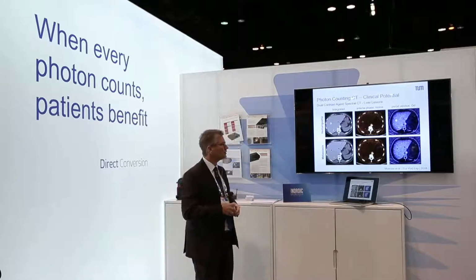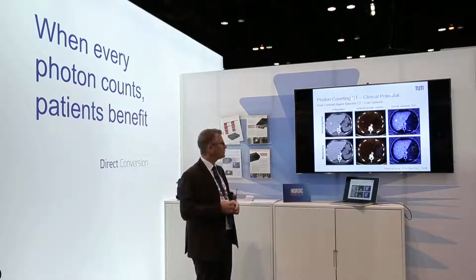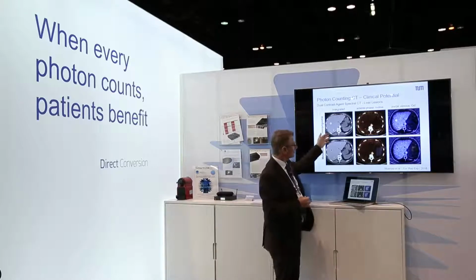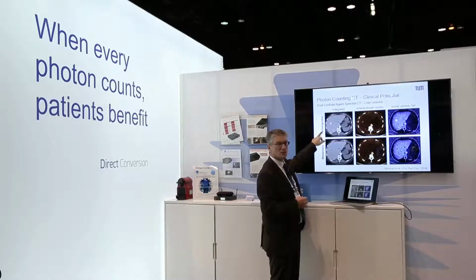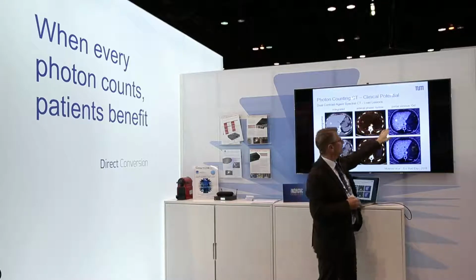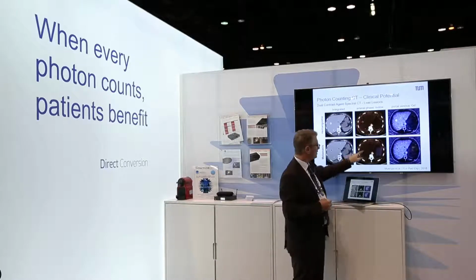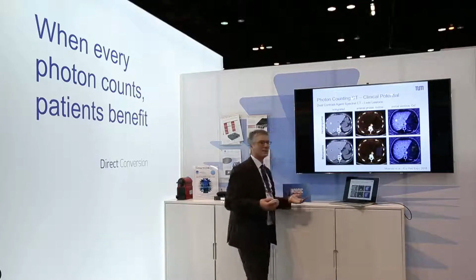That has been investigated in a couple of publications. This is an early simulation experiment where this was demonstrated in silico on liver lesions. Here's the integrated CT image of metastasis in the liver and some hemangioma, which is actually not pathologic, and they actually have a different sign. The hemangioma typically starts with some little contrast uptake in the outer areas and some filling in the later stages of the contrast agent distribution, and the metastasis presents with a rim both in the earlier stages and the later stages. So you could get that in one shot.